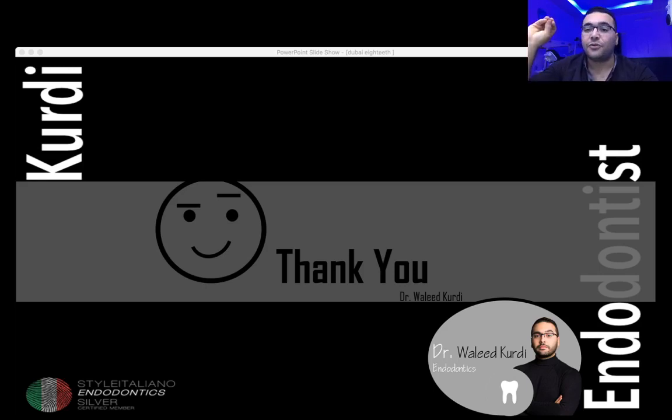I do not wait for the separated instrument to be loose, because sometimes the broken file may be broken due to torsional fatigue, and the tip will be engaged a little bit inside the canal, and if you have a longer file it will not be dancing or loose easily. And I'm telling you that the BTR pen can remove the file even if you have a coronal exposure of 1 or 2 millimeters without the file starting to be loose inside the canal.